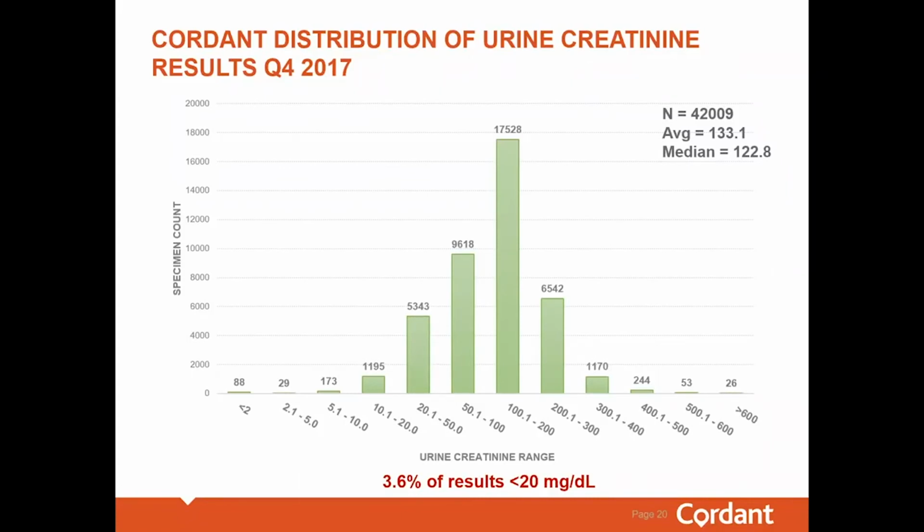This number is important to understand when faced with a donor that claims dilution wasn't intentional. Is it possible? Well, yes, there is that 2% population, but is it probable? No. Under 20 milligrams per deciliter is likely intentional dilution.